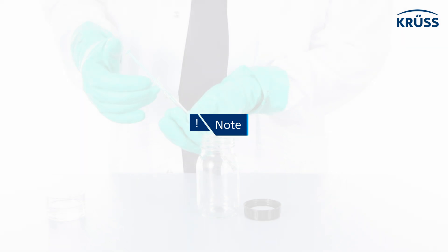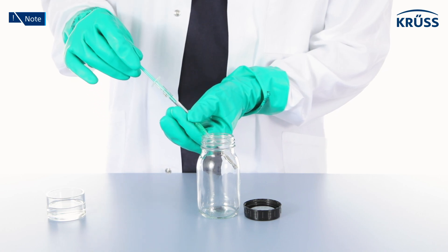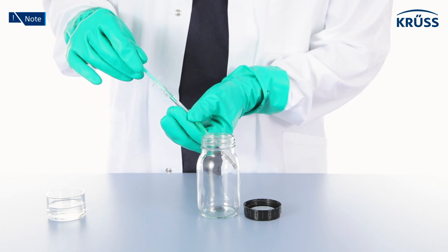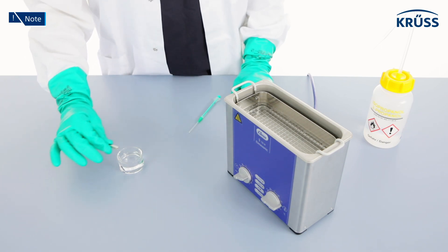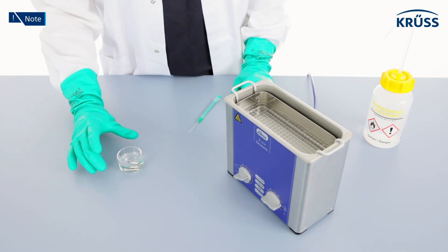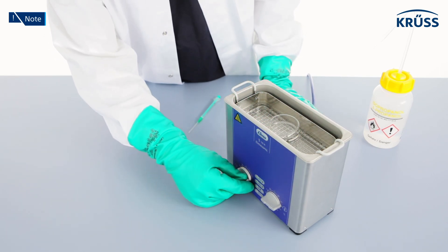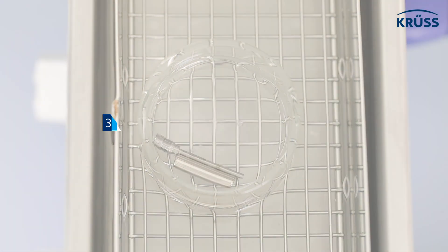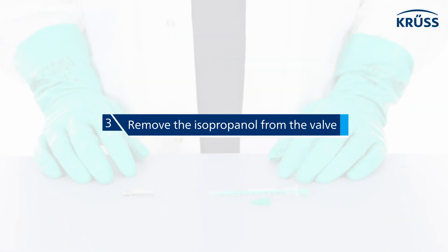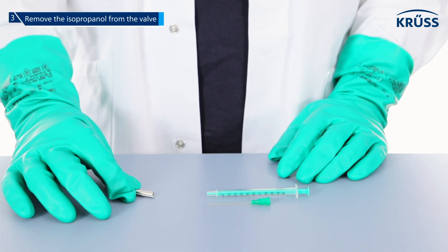If the isopropanol cannot pass through the valve or be pulled back up, or if the liquid flow out of the valve is not straight, then the valve is probably extremely contaminated. Place the valve with the rod magnet attached in a sample vessel filled with isopropanol and place the sample vessel in an ultrasonic bath for at least 30 minutes.